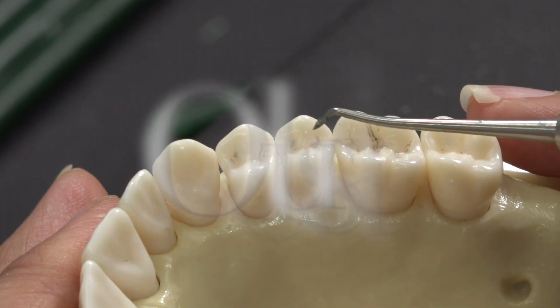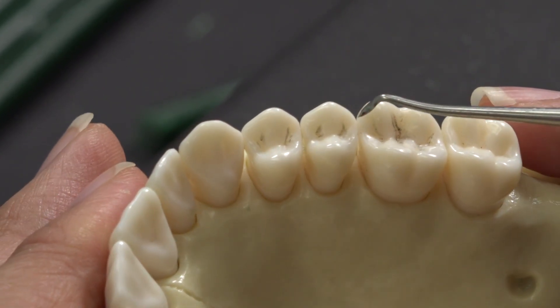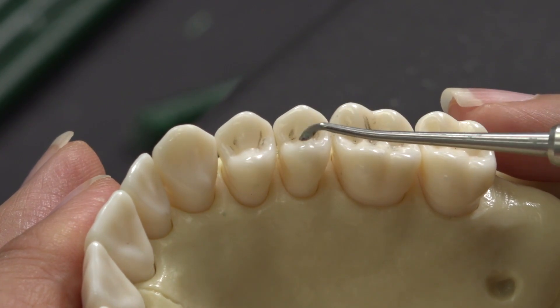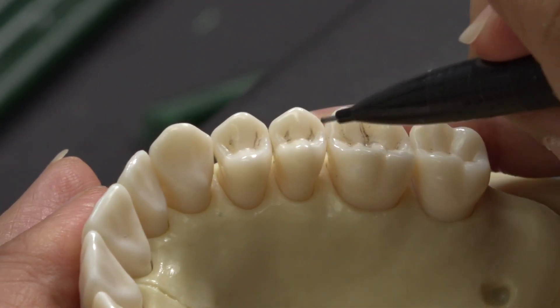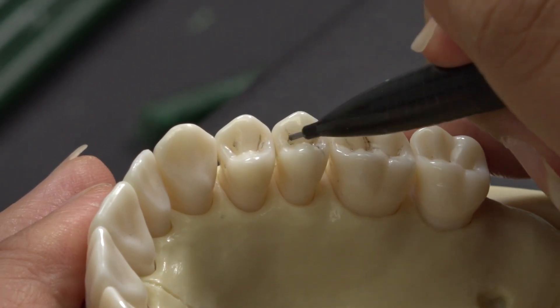Look at the contralateral and note the two triangles that make up the occlusal fossa and the raised ridges that connect the buccal and lingual cusp tips. Remember when drawing or shaping the occlusal, the mesial side is shorter than the distal side. This creates the illusion that the tooth is flared towards the mesial.